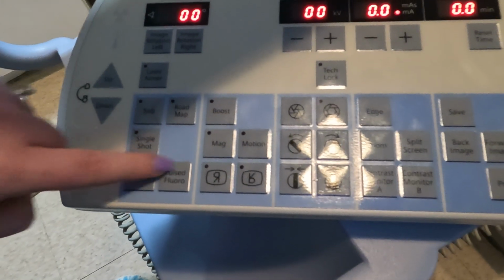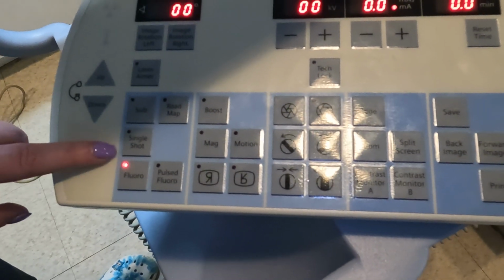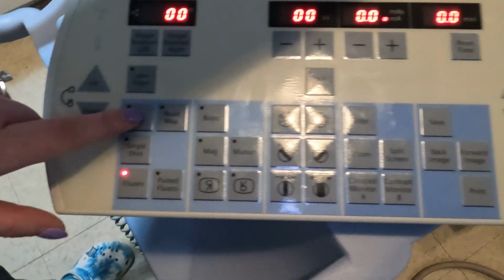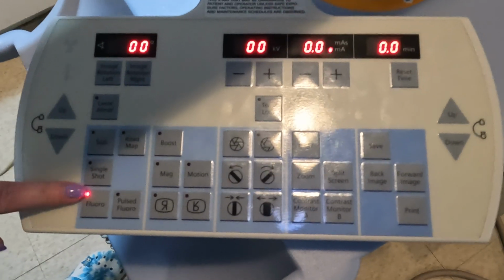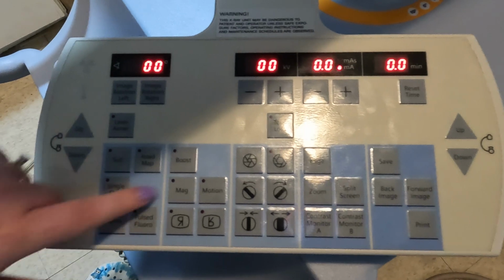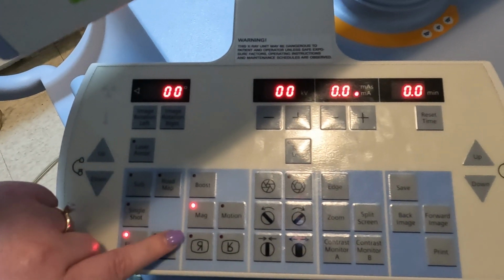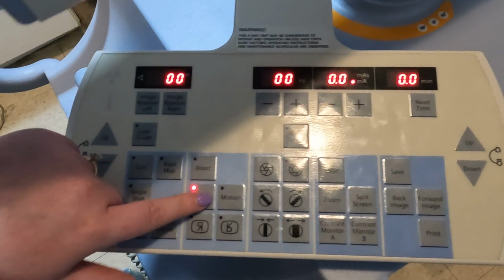All of those options that were on the screen are also here, so if for some reason you need to switch between fluoro and digital, they're both right here, and it will change on your screen. You also have the subtraction, road mapping, and pulse fluoro. Over here you have your R's, just like the OEC. Magnification is here. You have 2 steps of magnification. So if you notice, I click once, it lights up. If I click again, it's still staying lit up, and then you can shut it off.